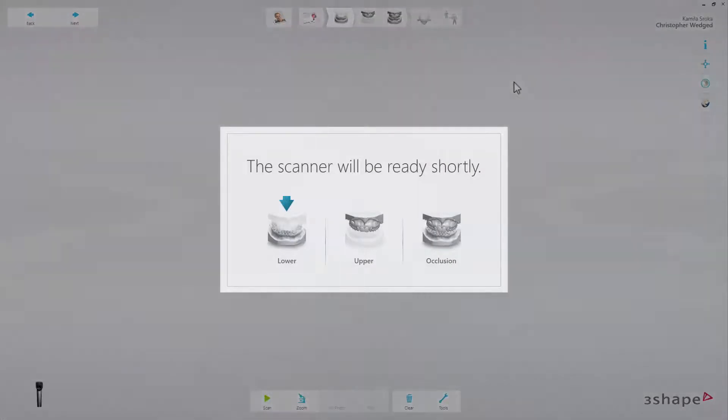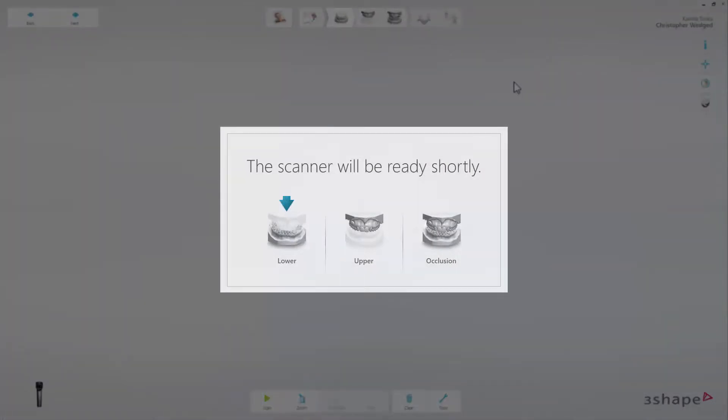The highlighted area, the central part of the user interface seen here, is where the 3D model is built during the scan process.